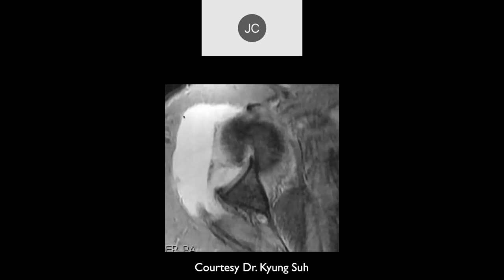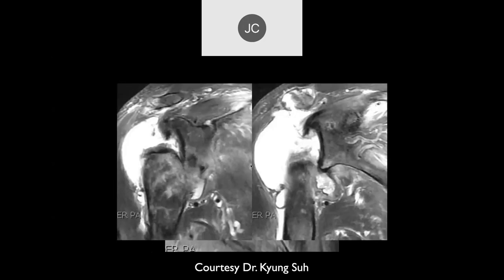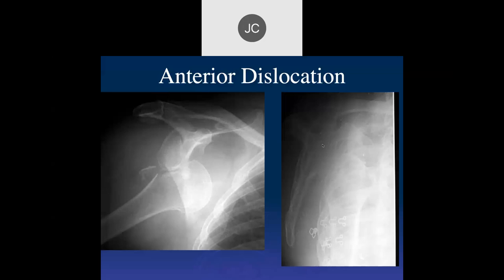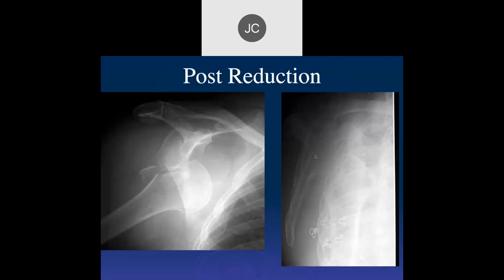On MR examination you can see the humerus is dislocated — not in the plane of the glenoid due to anterior dislocation. When this occurs, also look for other bone fragments in the area. On plain films again, here's the anterior dislocation, the Hill-Sachs lesion, and on the Y-view the anteriorly dislocated humeral head outside the glenoid fossa. Typically we'll take X-rays post-reduction.